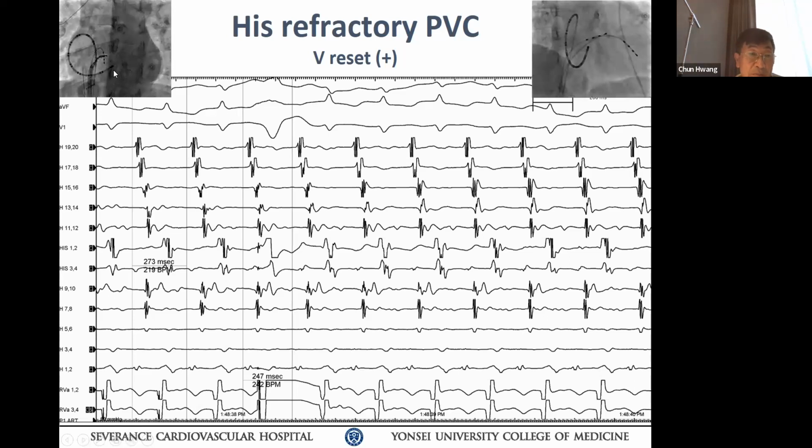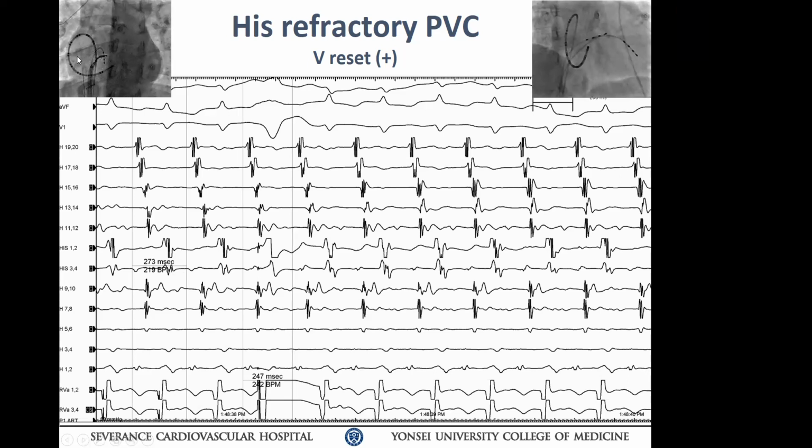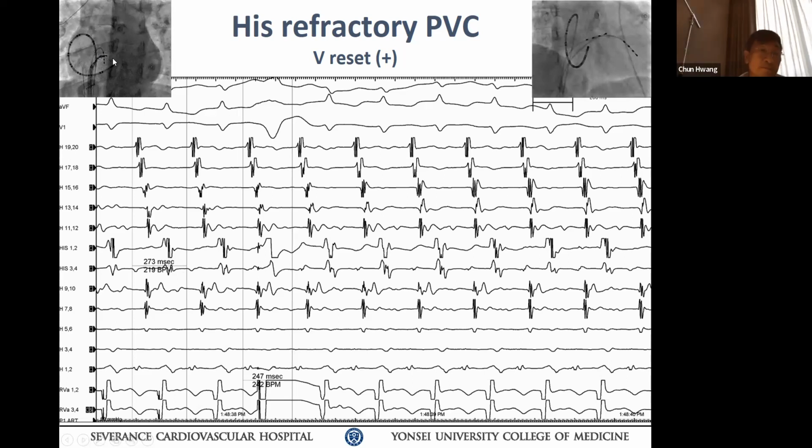Higher septum이야? H1920 두오데카 캐테터 1920가 어딨어? septum H, high septum. Keep going. 올라가야지. Good. Proximal. Very proximal electrode. 좀 더 올라가야지. 거기 엘렉트로드가 있는가? 잘 안 보이는데.